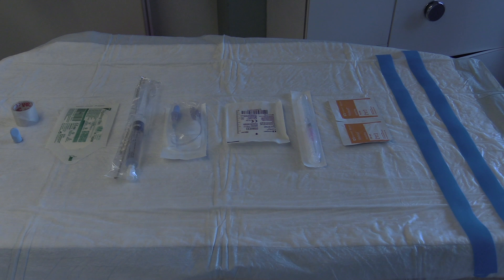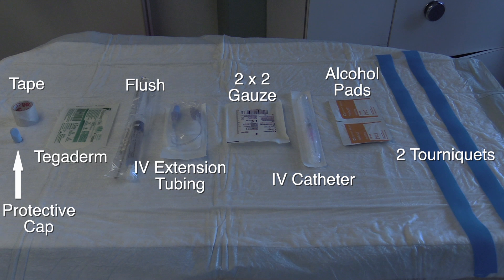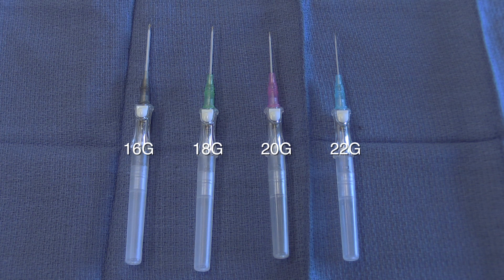The first step is to explain the procedure to your patient and prepare your materials. The required materials are shown in the order of use: tape, Tegaderm, flush, IV extension tubing, 2x2 gauze, IV catheter, alcohol cleaning pads, two tourniquets, and a protective cap.